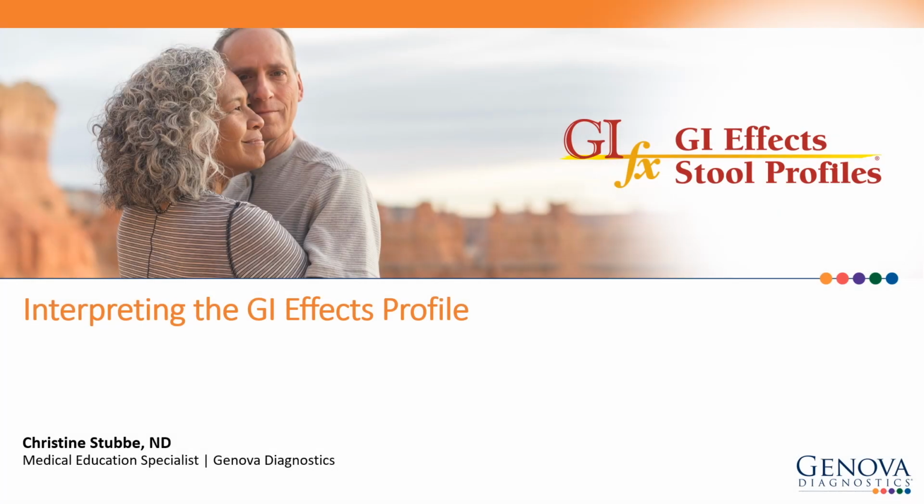Today we are going to review a GI effects report. This report is from a 72-year-old female who has had chronic diarrhea for about a year. She also experiences intermittent abdominal cramping. She had a normal screening colonoscopy about 8 years ago.